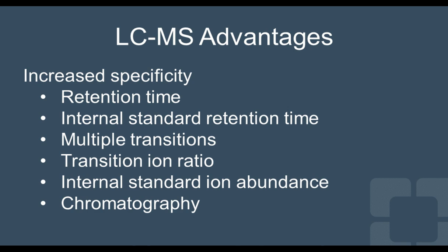Here, conversely, we look at advantages of the LC mass spec methodology. Mainly is the increased specificity. So knowing what you're measuring is what you're measuring. We have many quality measurements within an LC mass spec methodology that all need to be positive in order to produce the signal. For example, the retention time: if you build an assay and it elutes between 0.8 and 1 minute, you can always measure that, and if it's outside that window, it's not your compound of interest.